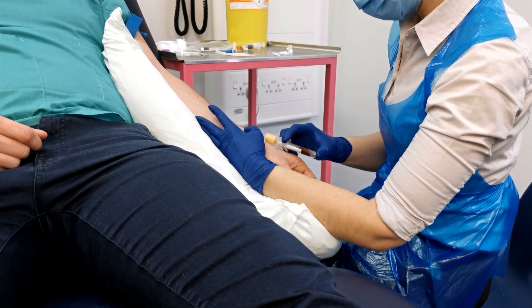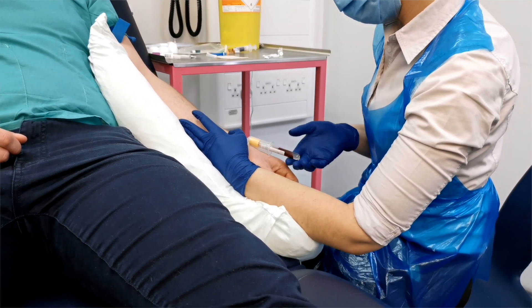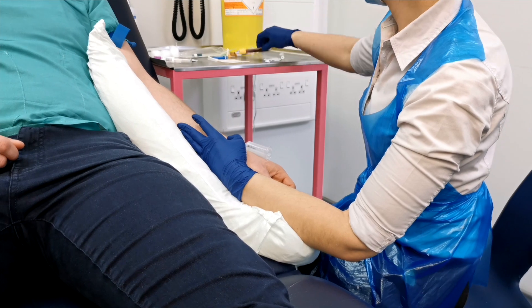It's also useful when placing an intravenous cannula to try and take blood off the back of the cannula to prevent stabbing the patient twice.